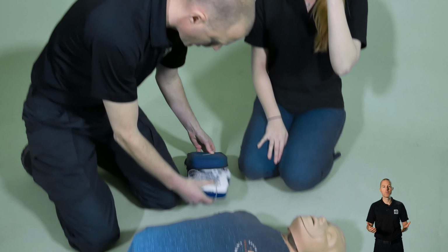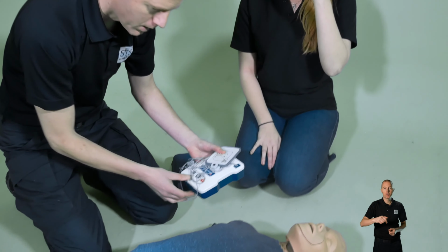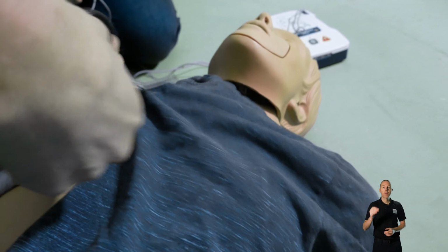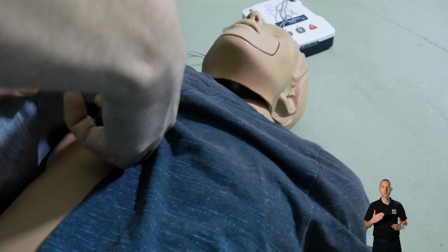Here is how to use one. Switch the AED on via a button or by opening the lid. Remove any clothing from the chest using the scissors. Place the pads onto the patient's chest. There will be pictures on the pad which will show where the pads are to be placed.